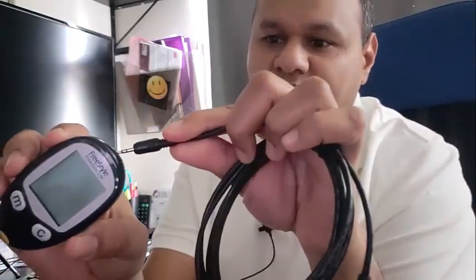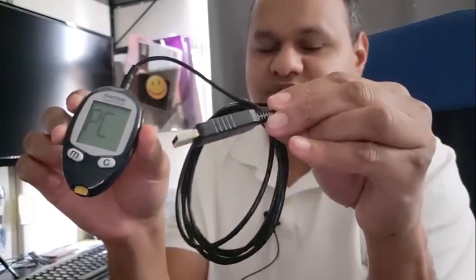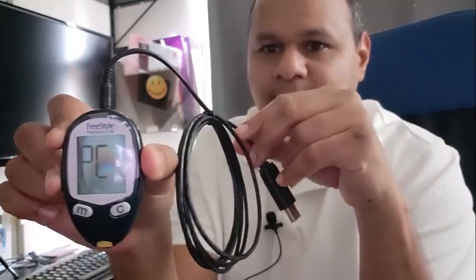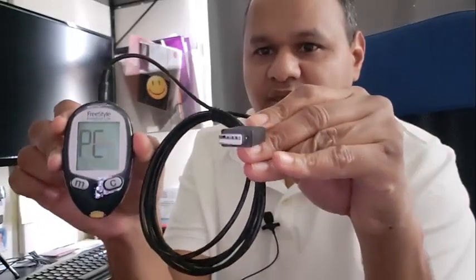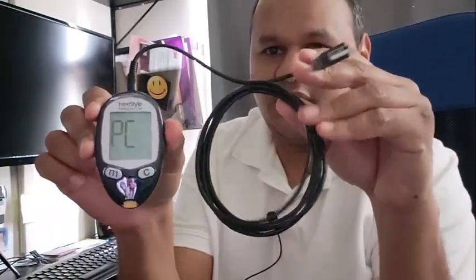When you first hook up the cable to the meter, it should say PC on the display. This is how you hook up the cable to the top of the meter, and then this part goes to either your laptop or your CPU. There you go — it says PC. If I hook this up to my PC it'll still say PC, which is a good sign that the cable and the meter are compatible.